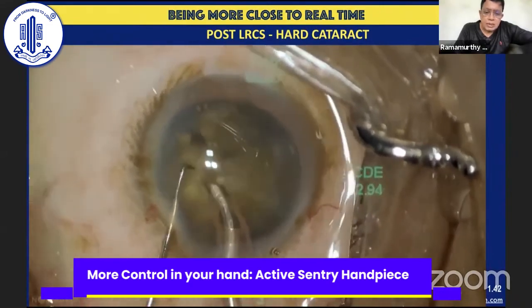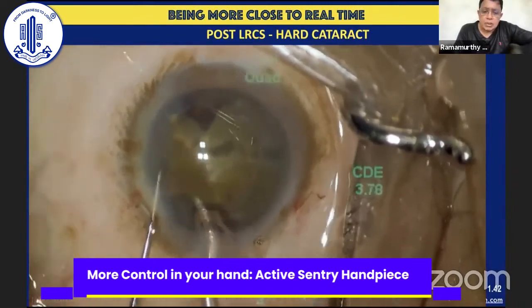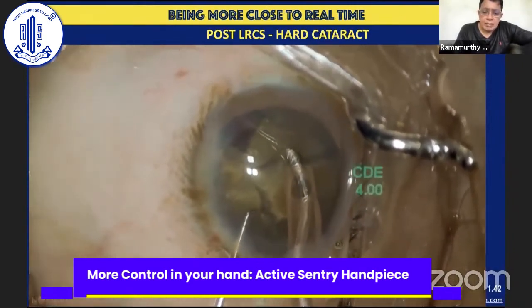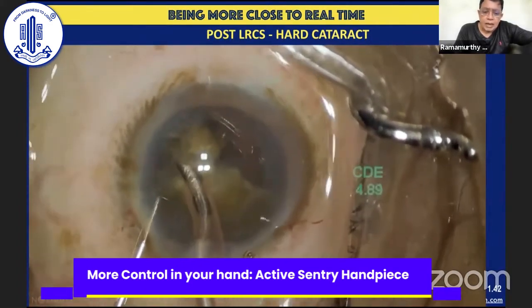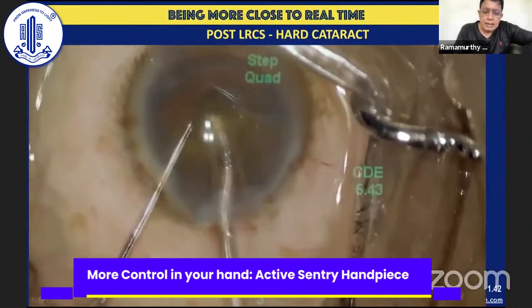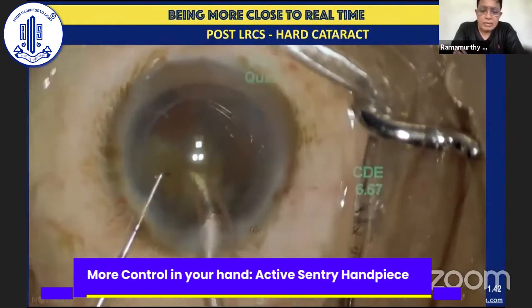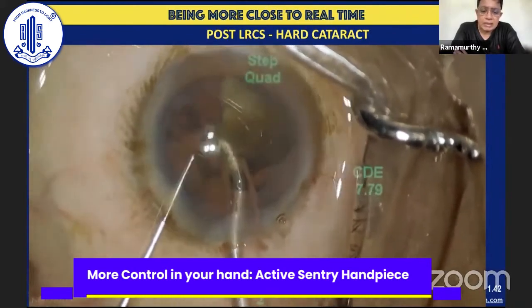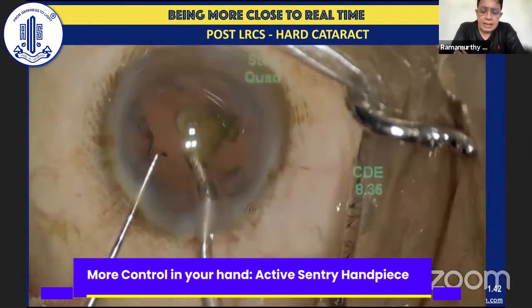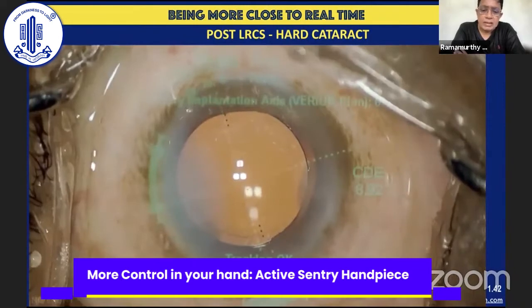But as was discussed, when it comes to quadrant evacuation, even though I try to keep the plane as posteriorly as possible, most of it happens in the anterior chamber. And using effective parameters, reasonably high flow rate, low intraocular pressure, makes the fluctuation somewhat less in a system like this, where you have the advantage of the active sentry as well as the active fluidics incorporated in it. You can see there is hardly much movement as far as the phaco tip is concerned. It's directed in a horizontal fashion, sometimes directed posteriorly because of the confidence that you have. And this is a Panoptix toric that has been implanted at the end of the surgery.